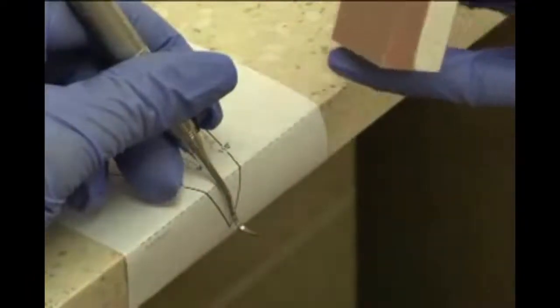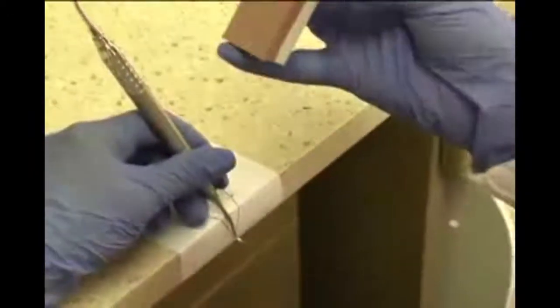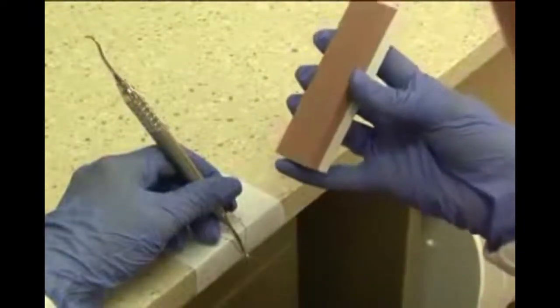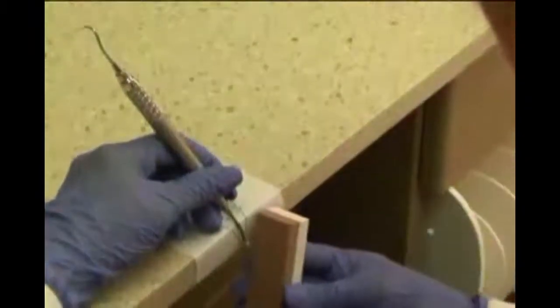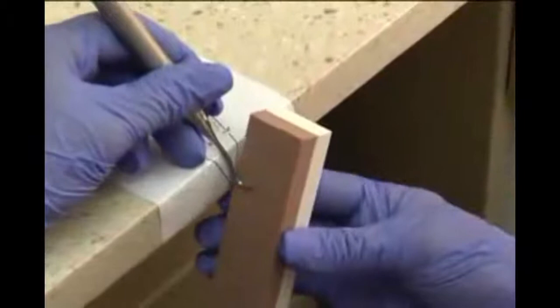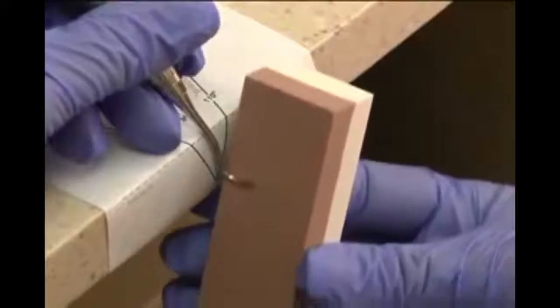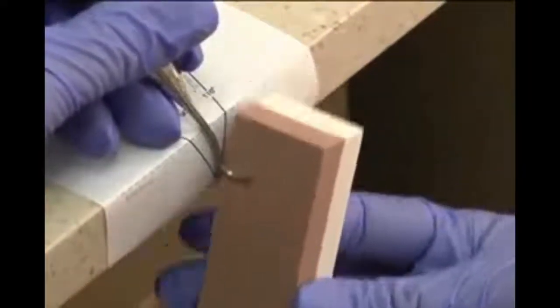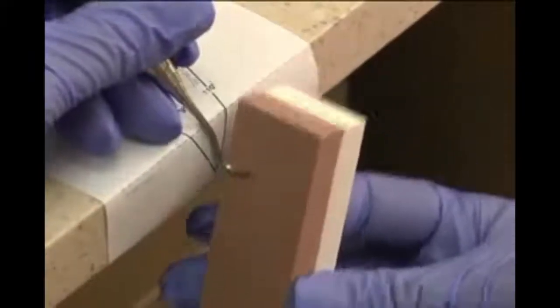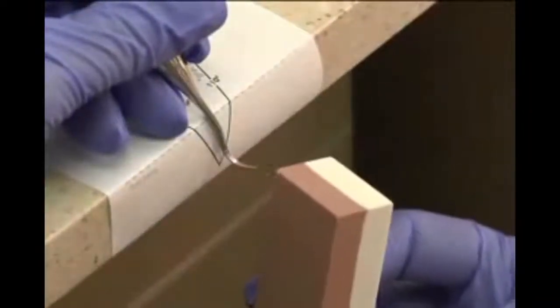And I'll hold the stone with my thumb on one side of the stone and my four fingers on the other. And sometimes, if you feel more comfortable, you can hold the stone with your pinky underneath to stabilize. So with the H6/7, it has a bit of a flame shape. So I don't want to just stick to the 110 here. I want to tuck in a little bit, and I'm going to apply heavier pressure going down, lighter pressure coming up. And I'm doing the back, middle, and the toe, ending on the toe.